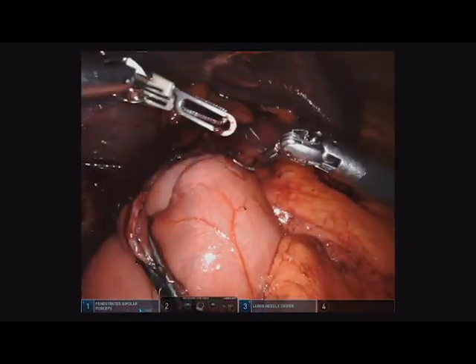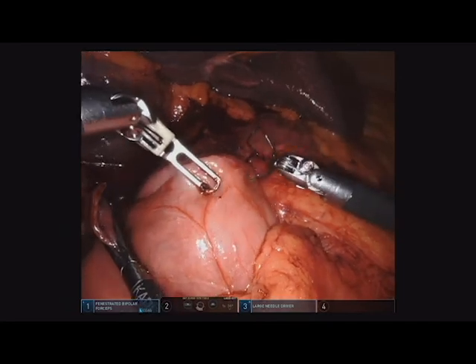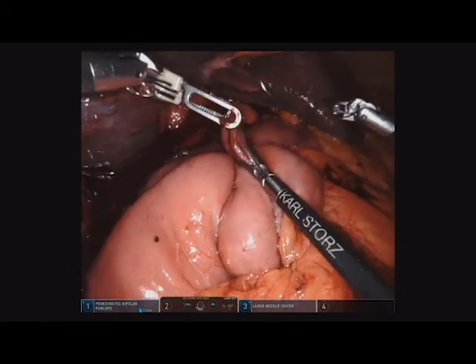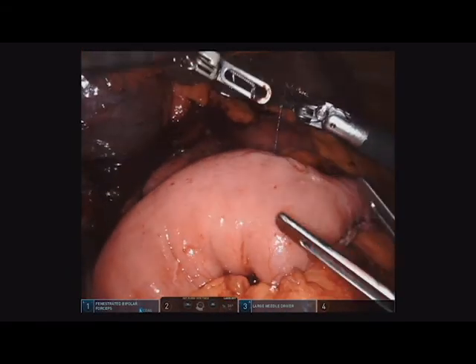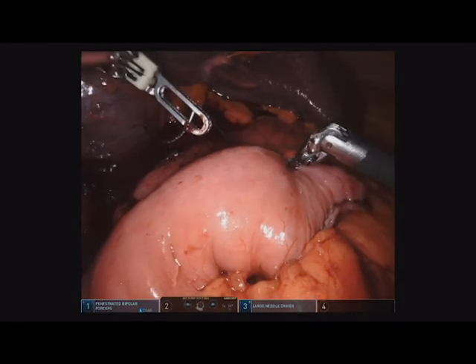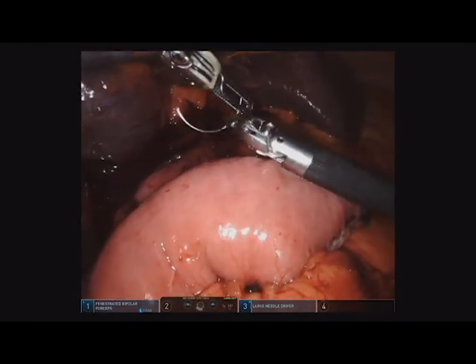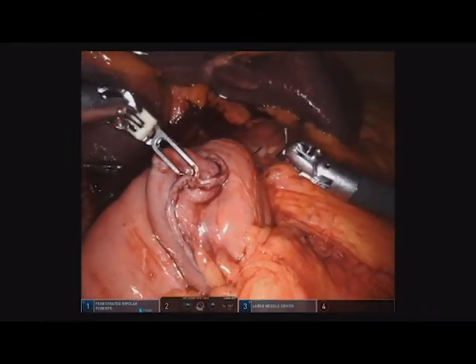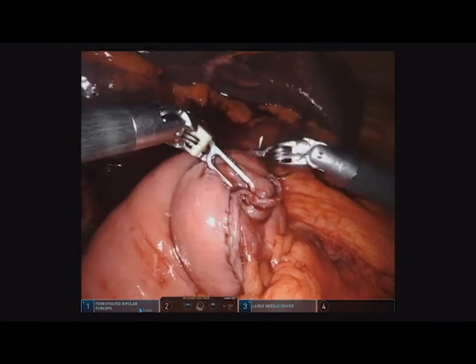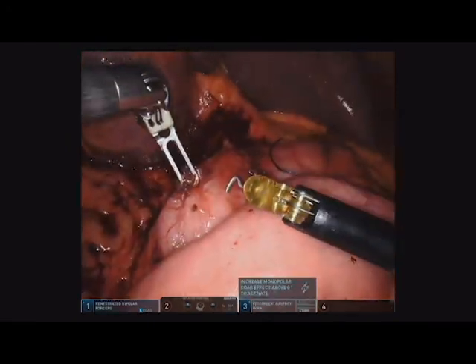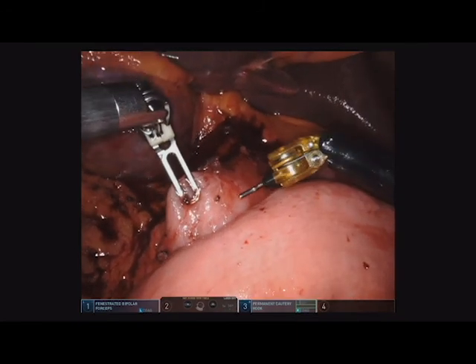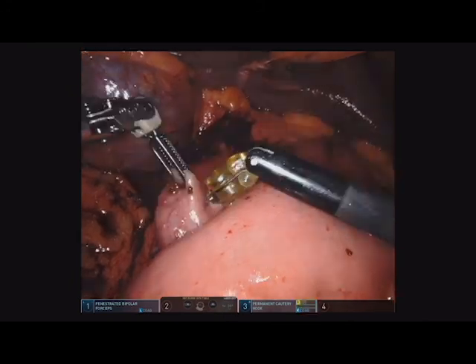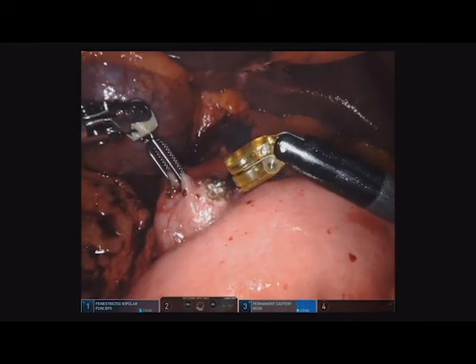Three-zero Vicryl was used to create a posterior seromuscular row, and this can be seen at present. The orientation of these limbs is to create an isoperistaltic joint. Once the posterior row is complete, the jejunum lies in the supracolic compartment in the proper orientation. At the end of this process, enterotomies are created on both limbs — the duodenum and the jejunum respectively — keeping in mind that there is a posterior cuff of tissue for the back wall to be stitched as far as the actual anastomosis is concerned.